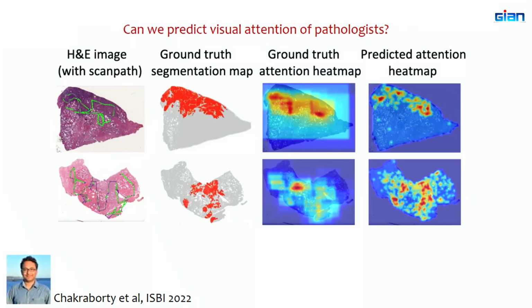So we spoke about radiologists. Tomorrow we'll be talking about many of the projects in digital pathology, but here's an example of what can be done and what one of our other group members has done with digital pathology. They want to take these images. These are all pathology slides that you see here. These are digital pathology scans.